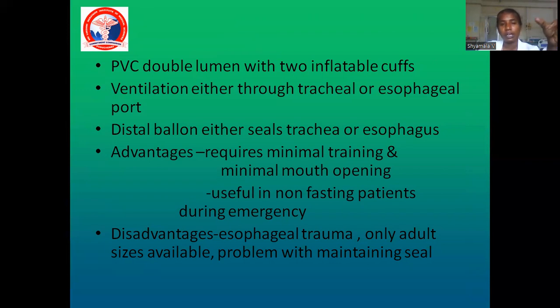Main advantage, it requires minimal training and minimal mouth opening. Very useful in non-fasting patients during an emergency because it goes into the esophageal inlet. Okay, the distal cuff, as I told, goes and fits into the esophageal inlet.